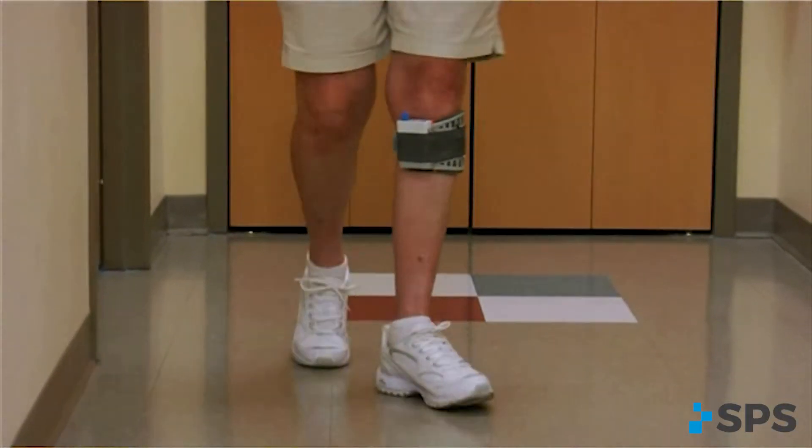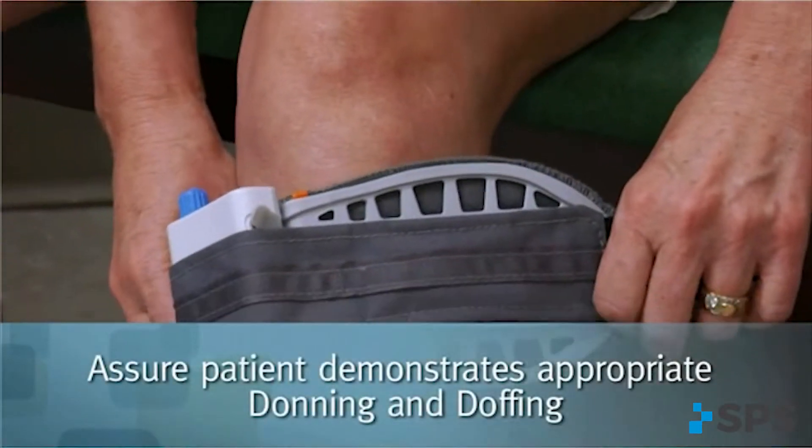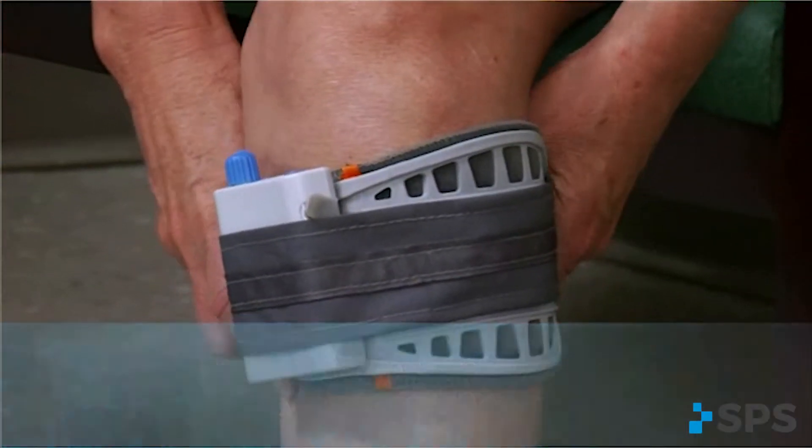Observe the patient walking with their tilt program and make any necessary adjustments. Watch the patient don and doff the WalkAid several times before releasing them.